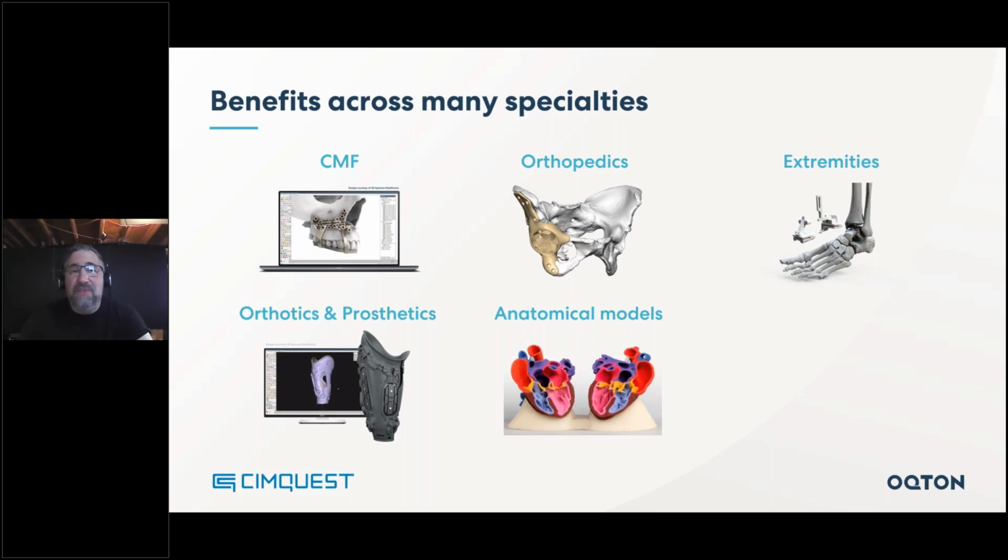Anatomical models, there's an art to creating anatomical design models. Segmentation is just a small part of the puzzle. Artfully coloring, creating supports, connection structures, often required, which, when done correctly, blends seamlessly, but it is something that needs to be considered, and Freeform is a fantastic tool for this job. Finally, radiotherapy.